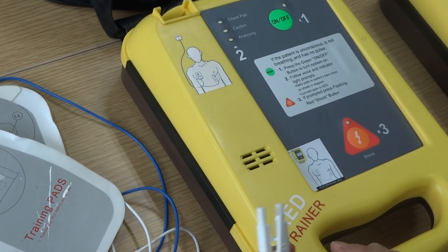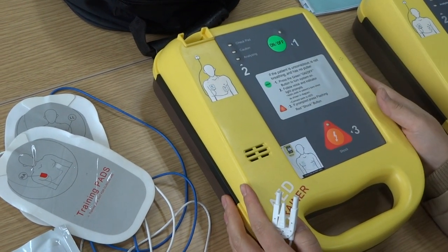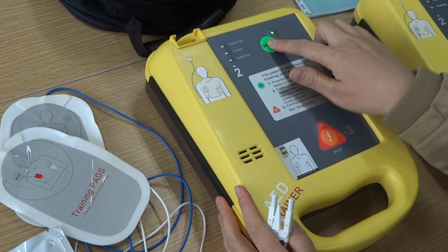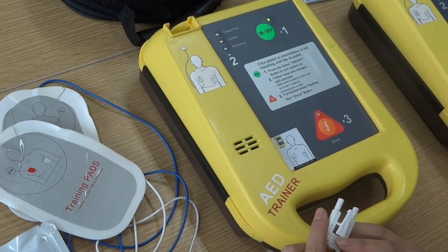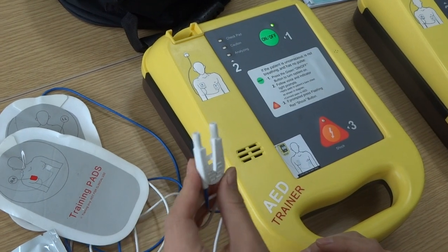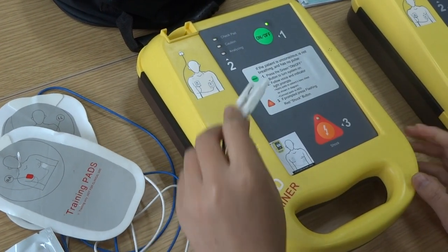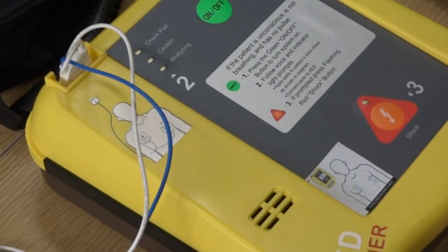For example, if we do not connect the pads to the device, it will prompt 'check the electrodes.' Let's try it — turn on by pressing the green button for two to three seconds. It will analyze automatically. Because we have not connected the pads, it will prompt to check the electrodes. Then we connect them — just push it in. Now it begins analyzing: 'Analyzing... do not touch the patient.'